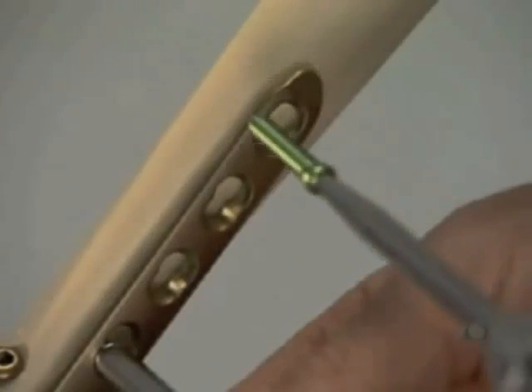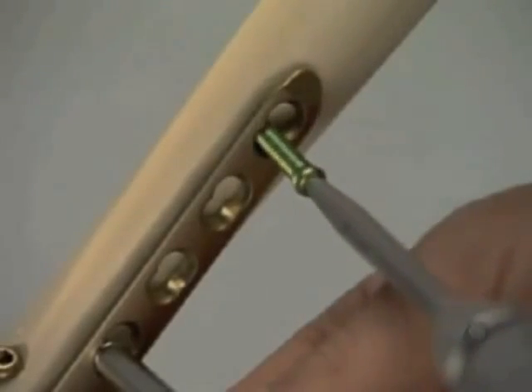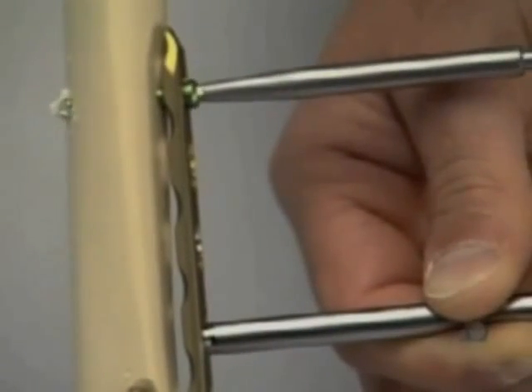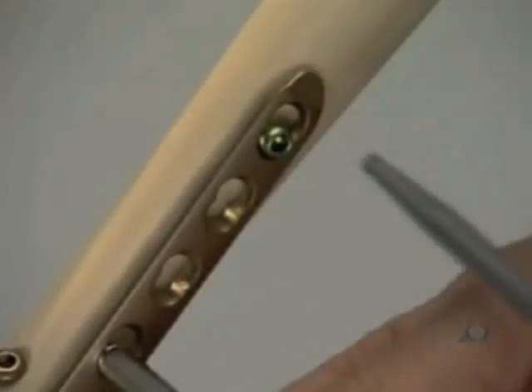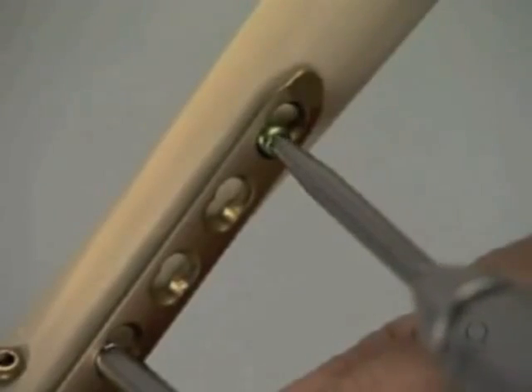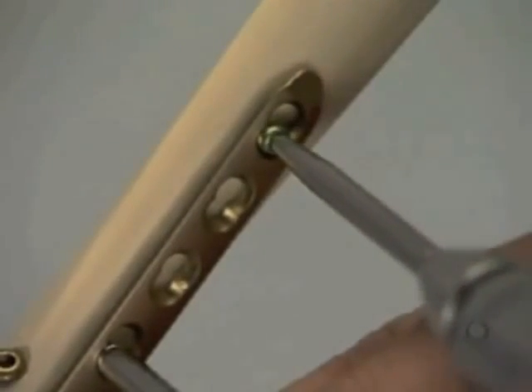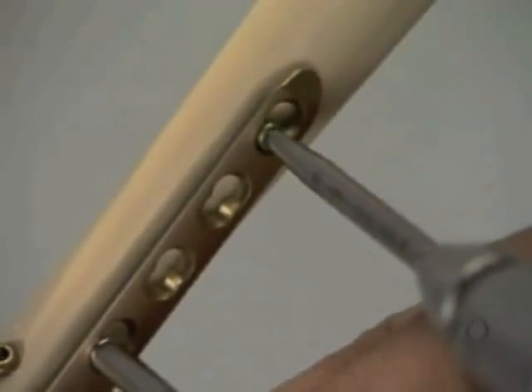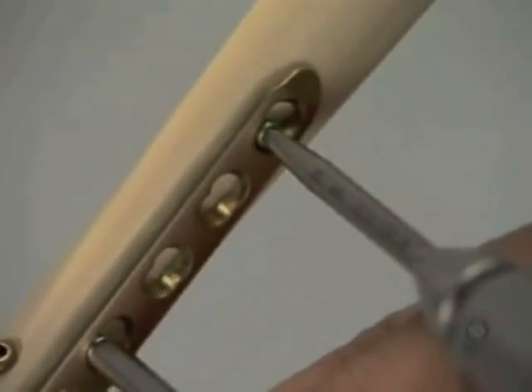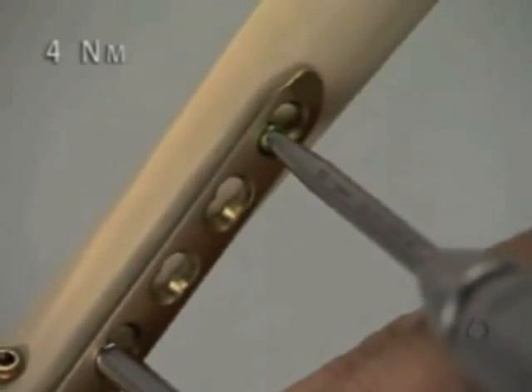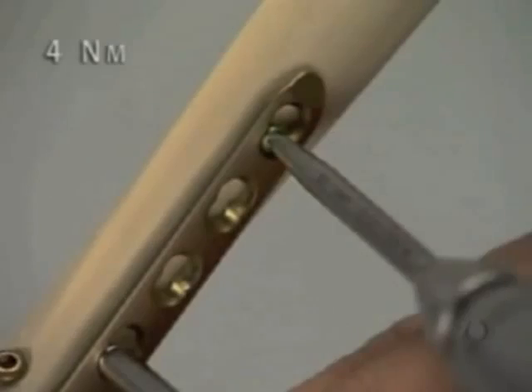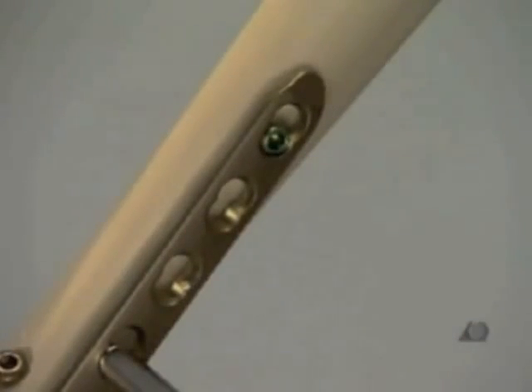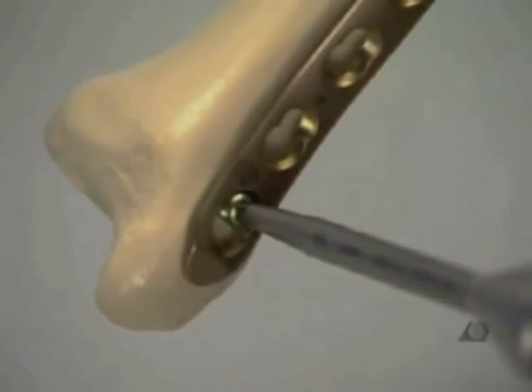A self-tapping locking head screw is inserted. The screw head is locked in the plate by hand with the torque limiting screwdriver. When the maximum of 4 Nm is reached, a click is heard and felt. The screw in the most distal hole is now tightened.